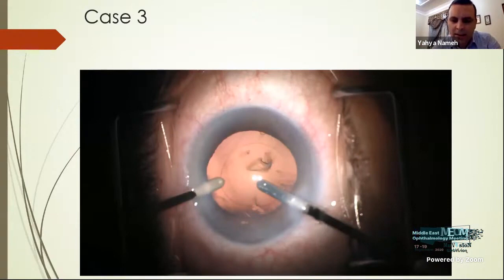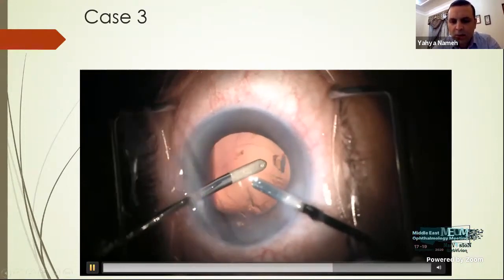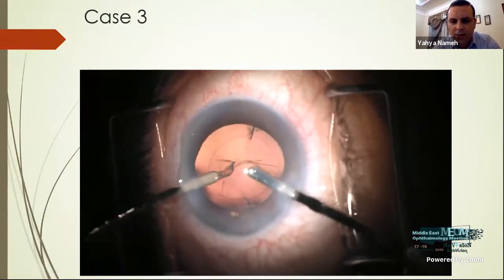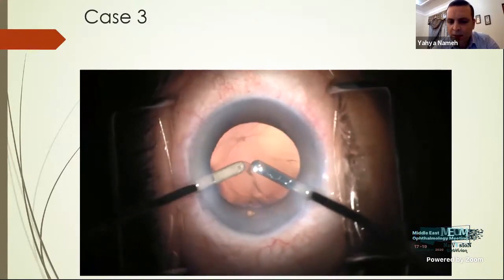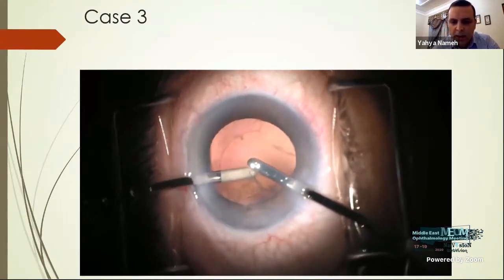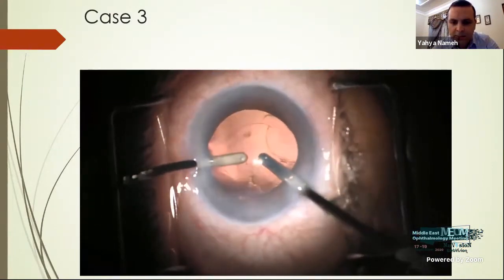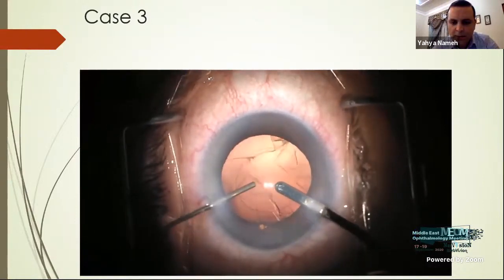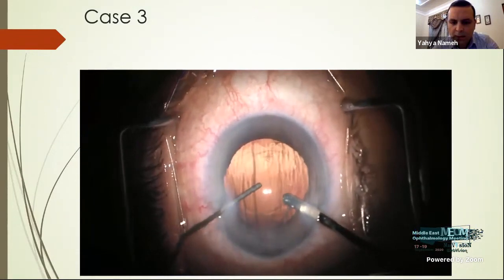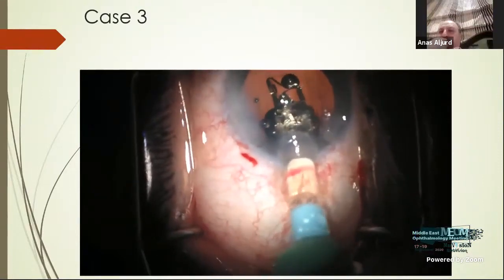After discussing this case with some friends, I heard a suggestion like yours, to put in a CTR and then implant. Finally, I finished the case without any rupture of the posterior capsule. You see here how redundant the posterior capsule is. I proceeded with implantation of the trifocal lens without insertion of a CTR, just a plate haptic lens. But it was a wrong decision.